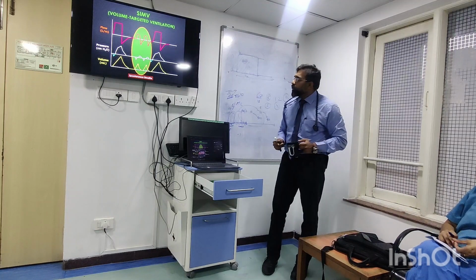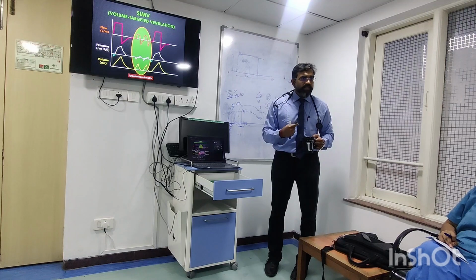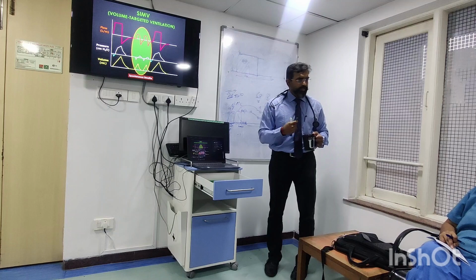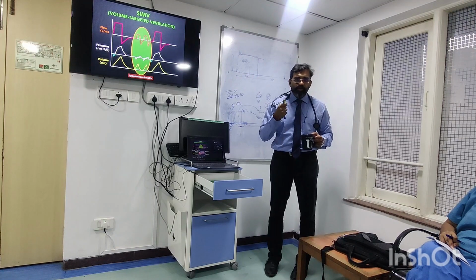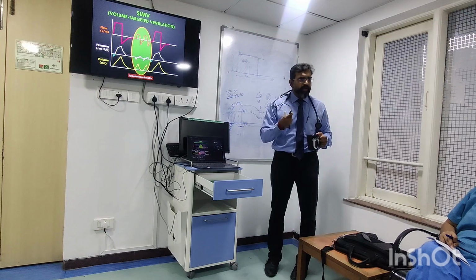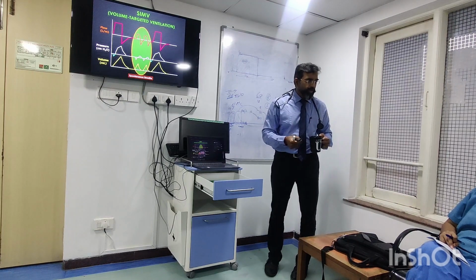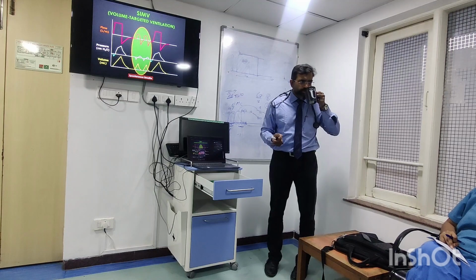So it used to be a very catchy question in the exams. In our exams, it used to be a very catchy question: how do you set the SIMV period? Because it is something where you have to understand the ventilator. What is the scissor valve? What happens inside? We used to open the ventilator. Our exams were also based on opening the ventilator and telling what is wrong in it. It used to be like that for us, because of course we had to know it. We were in a situation where we didn't have so many technicians. You understand?